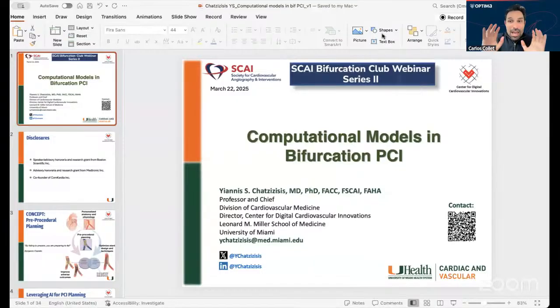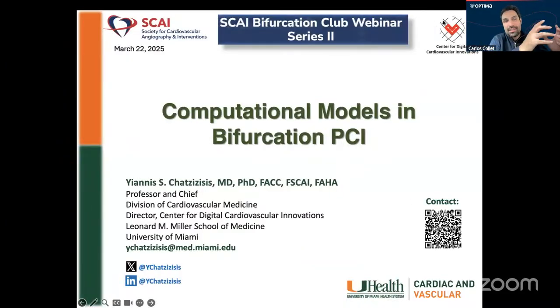I have to say that I'm pretty curious. You said superiority. I think that we're not aiming at superiority of CT-guided PCI, but that's going to be P5. In P5, we're going to do superiority of planning with CT versus no planning, because in the meantime, Nick, we kind of understood that there is a big value, as you said, to plan the procedure. It can be a CTO, it can be a left main, it can be a bifurcation, but if you go in already with a deep understanding of the disease, that changes the procedure from the decision making, also from the technical part. Thanks, Carlos.